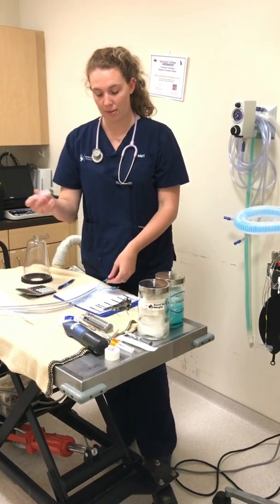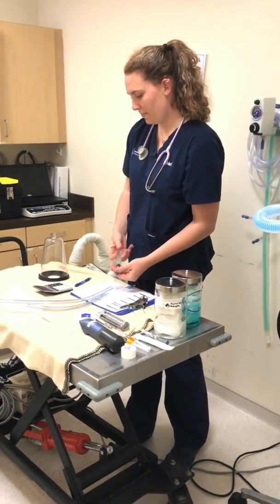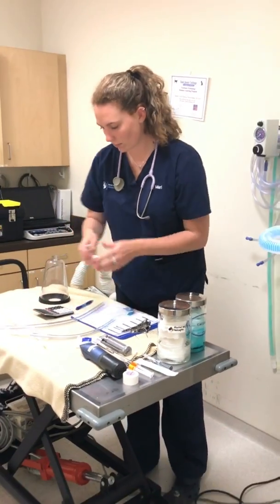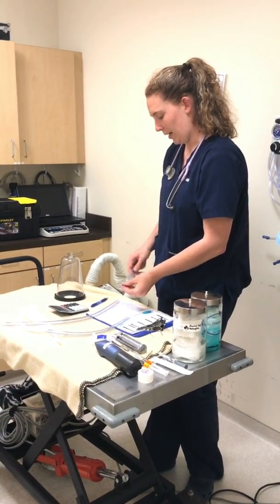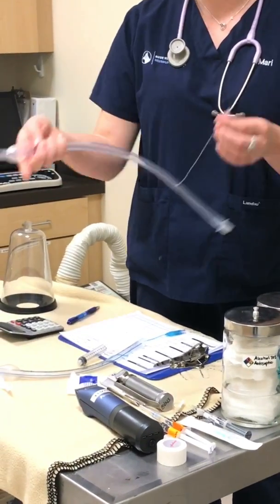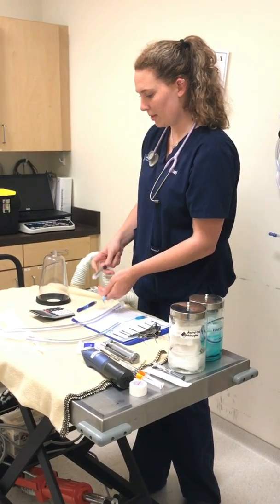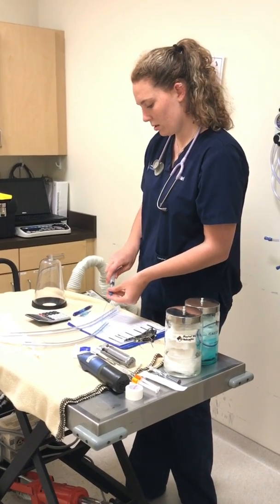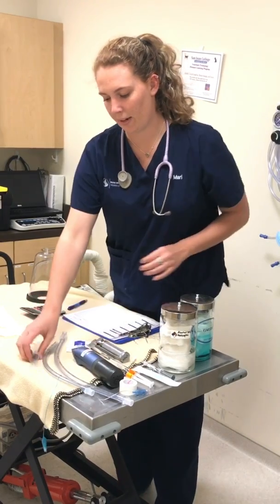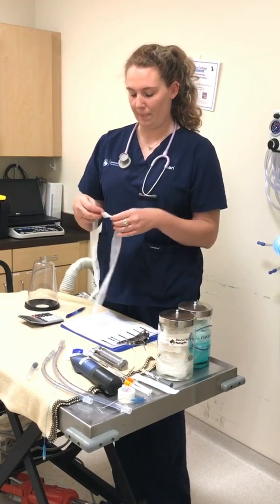I'm going to go ahead and use my cuff syringe to inflate the cuffs, just to make sure that there's no leaking. Okay, so our 10 millimeter is holding pressure well. I'll go ahead and do my 11 millimeter, which is also holding pressure well. I'll go ahead and deflate those just to make sure that they're prepared for placement.